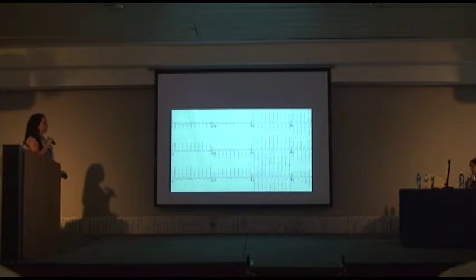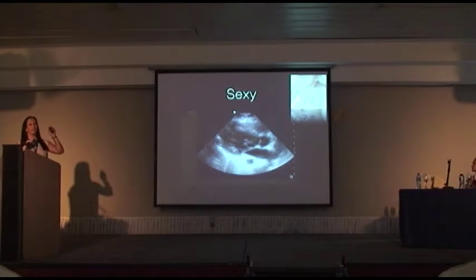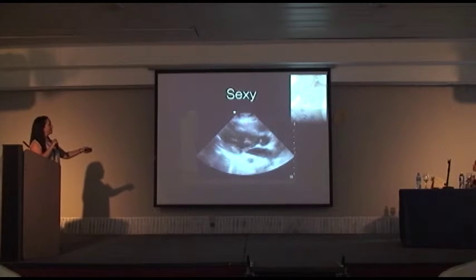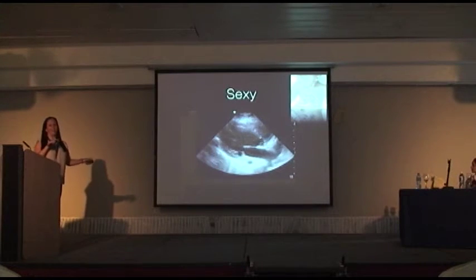This is SVT. So when you have a kid with SVT, take everybody in the room and show them this. Put the ultrasound on the patient. You will see here the heart's going crazy. You'll see bubbles of adenosine go into the right ventricle, and wait for it. The heart will stop. Wow. I know, right? Everyone always cheers for that.